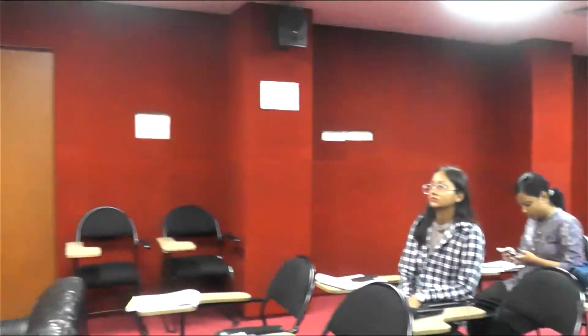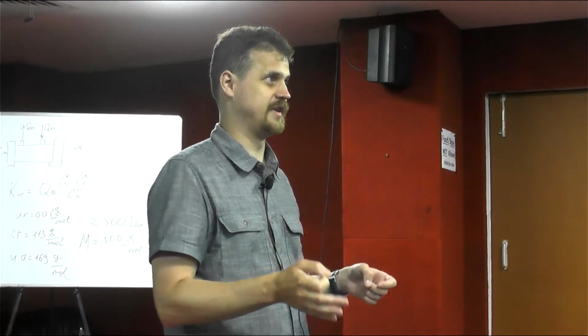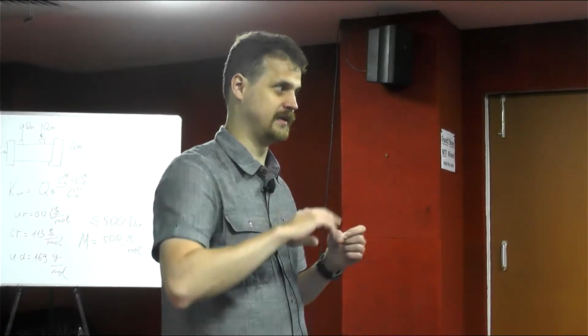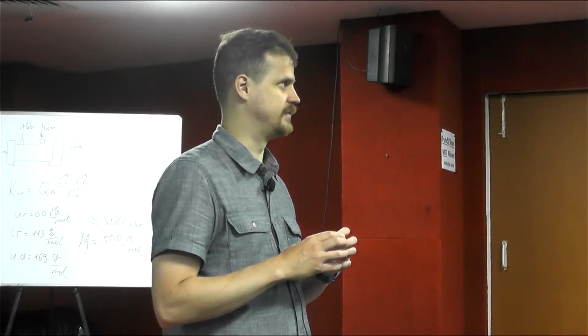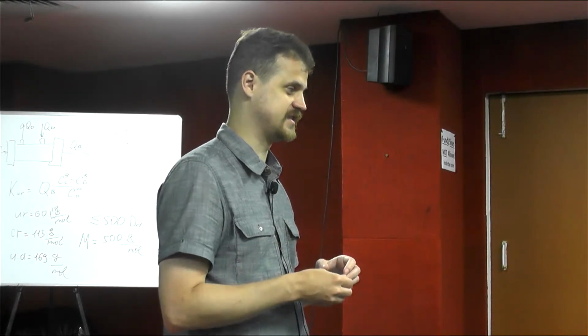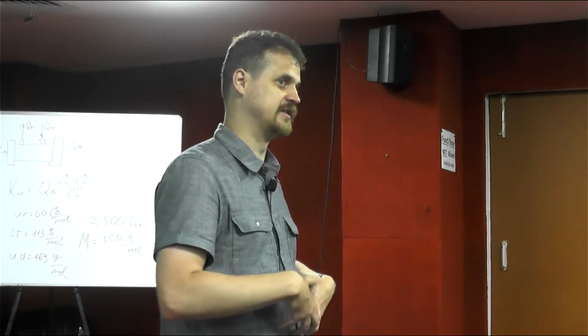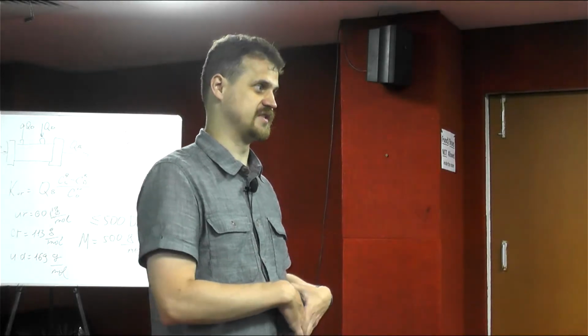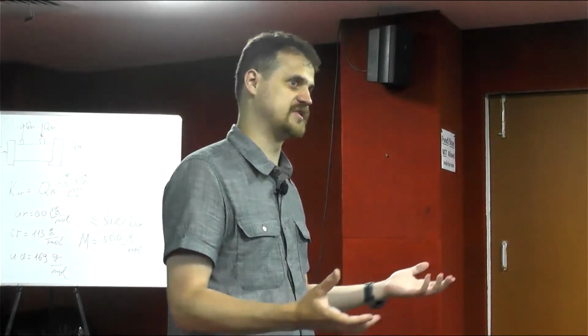send the data to the smartphone or to the doctor. And we cannot just put a lot of wires in the patient in that regard. So that's exactly the issue that we have to address as well, the wireless data link, which we need to evaluate. If we use some frequencies, we need to make sure that the radiation that different devices produce during this data transmission will not heat up the internal parts of the implantable kidney. It will not heat up the tissue of the patient's organism. It will not affect the composition of those tissues.